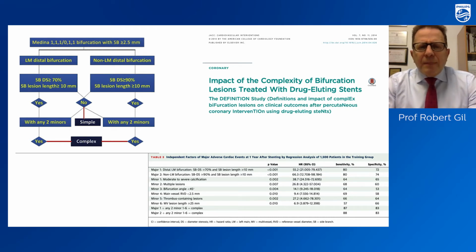I really suggest using it, because it makes your life much easier when you base your decision not only on your feeling, but also on very strict numbers and analytical features.